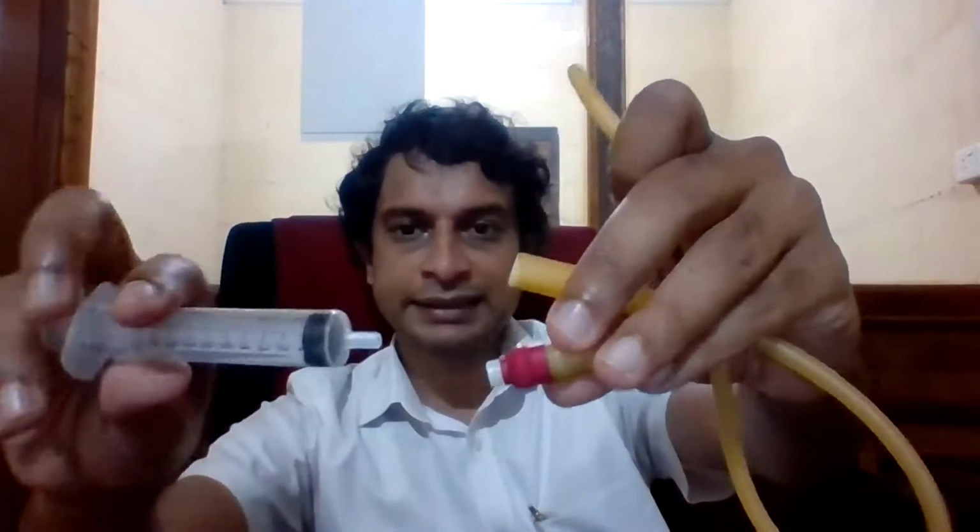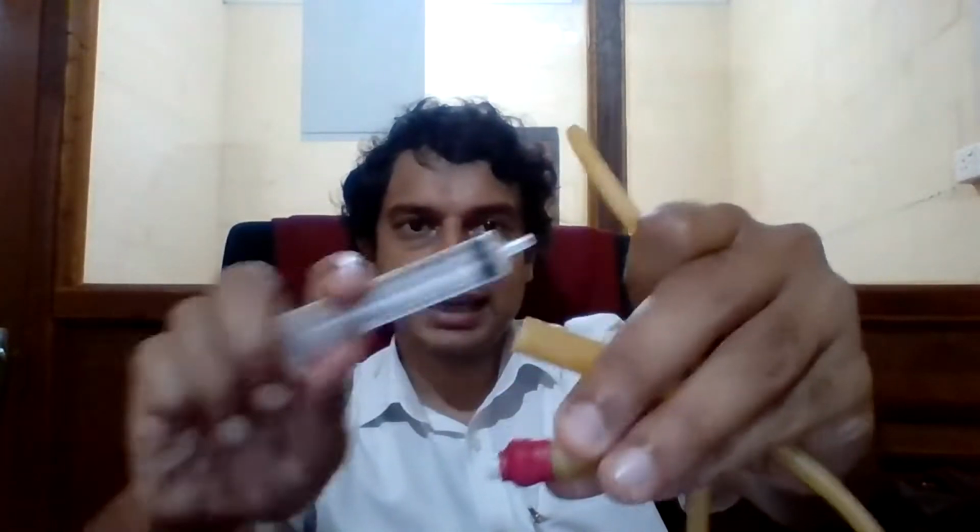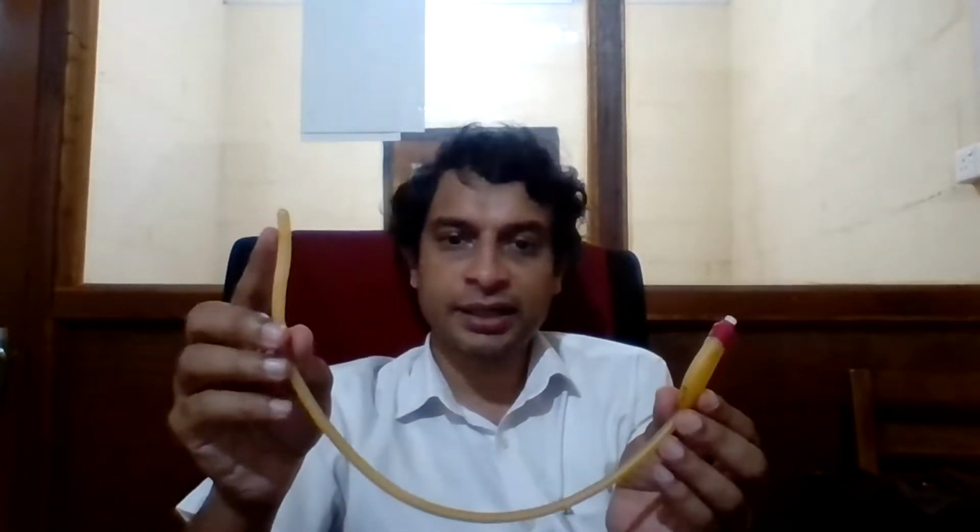So what I'm going to show you now is with a syringe, right? I'm going to inflate over here, and you will see this balloon over there inflating, right? So the balloon inflates and deflates. What do we usually inject into the balloon? Is it air that we inject into the balloon usually? No, normal saline. It's safer if you inject distilled water instead of normal saline, because saline has salt in it. Sometimes a bit of salt can go and get blocked inside this, and you might not be able to deflate the catheter after that. Okay, it's safer if you inject just sterile water into it instead of that.